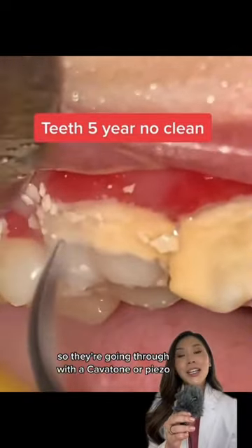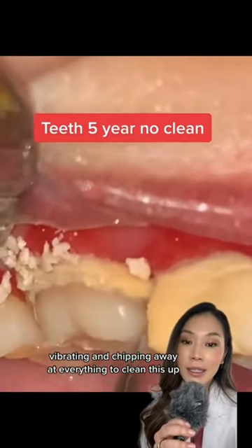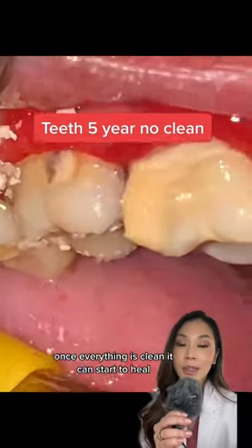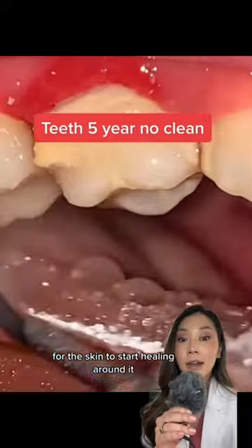It's actually really hard to the touch. So they're going through with a Cavitron or a Piezo, vibrating and chipping away at everything to clean this up. You can see how inflamed the gums are around there. Once everything is clean, it can start to heal — it's kind of like having to remove a splinter for the skin to start healing around it.